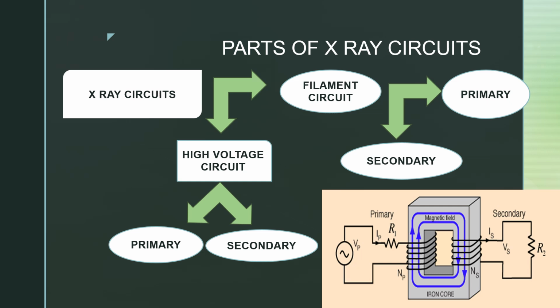In the context of electronic engineering, the primary circuit and secondary circuit are commonly used in the context of transformers and other devices that use electromagnetic induction to transfer energy between circuits. Now, what is the primary circuit? The primary circuit is the initial circuit that is connected to a generator, or it is mainly wound in the primary winding of a transformer. It acts as the input current to a transformer.